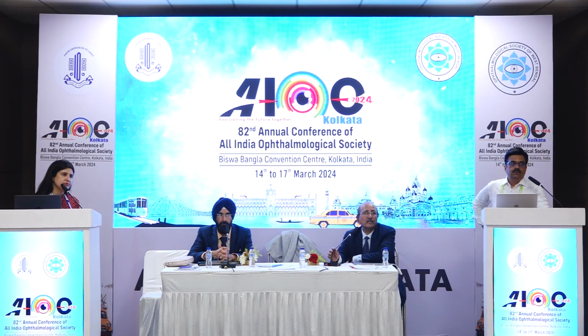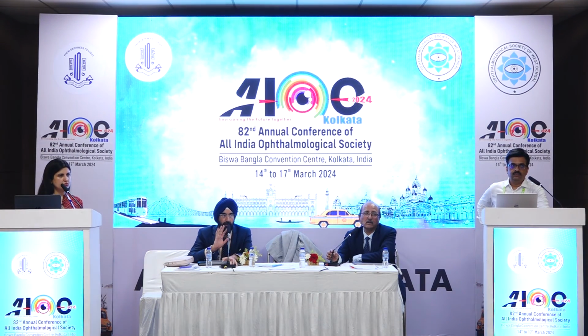Madam, do you dilute it? No, we don't dilute. We just put 4 units, 0.05 milliliter, 1 cc. Do you use a syringe, or do you use a fine syringe like 30 gauge? Yeah, insulin one, yeah.